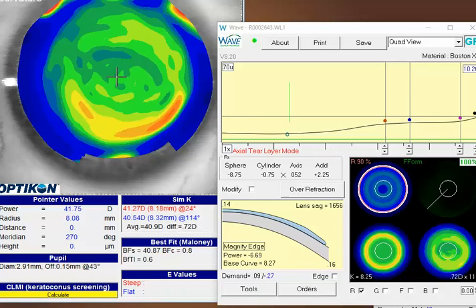I see from your request that you're struggling to keep this lens centering on the eye. Well, if we look at your topography, although it's pretty well centered area of the cornea here, you'll see you've got this little ridge from the prior contact lens wear, and when you're putting a spherical lens over this eye, in theory, you should be able to just smooth that out very nicely. However, it sounds like your lenses are dropping quite a bit.